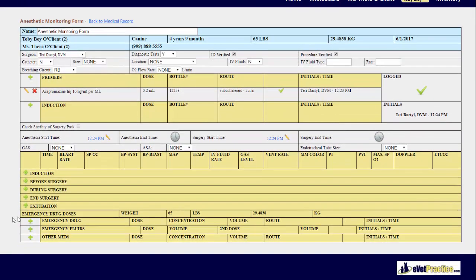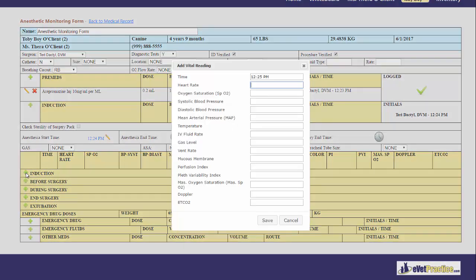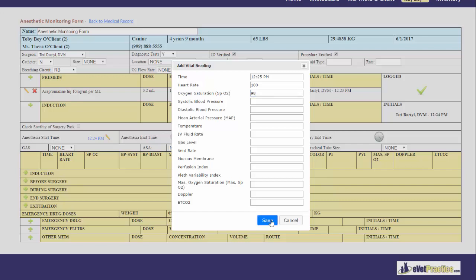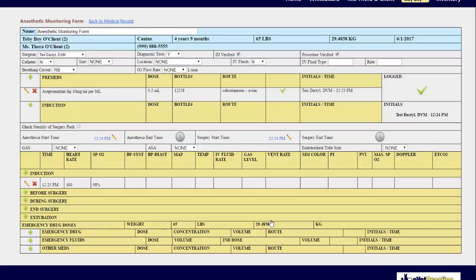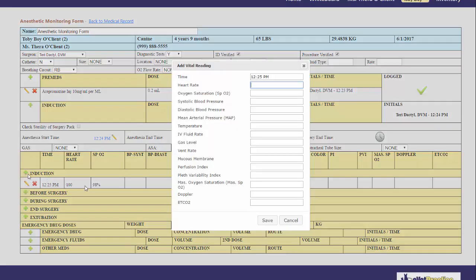Down below under induction, before surgery, during surgery, end surgery, and extubation, if you click the plus sign beside one of these, this is where you have the ability to enter in the vital readings. You do not have to fill out every single field, just the ones that you're needing to complete. If you conducted multiple vital checks, you can click the plus sign to add in an additional entry.